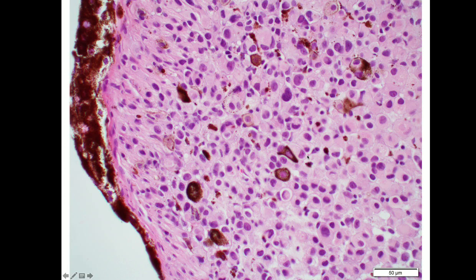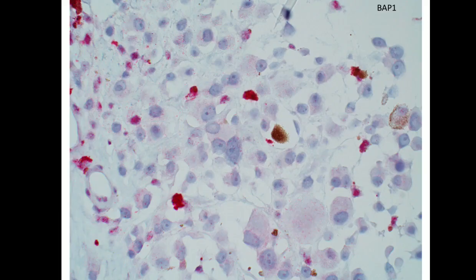It happened to be epithelioid, but it was so small that this is one setting where we couldn't get fresh tissue. It would have been quite hard to bank. We couldn't get our molecular test because ours is based on fresh tissue. But this is where our BAP1 was quite informative as well. Again, you've got to ignore the tumour-infiltrating macrophages and look at the tumour cells, and it's BAP1 deficient, so probably would correlate with monosomy 3 as a surrogate marker.